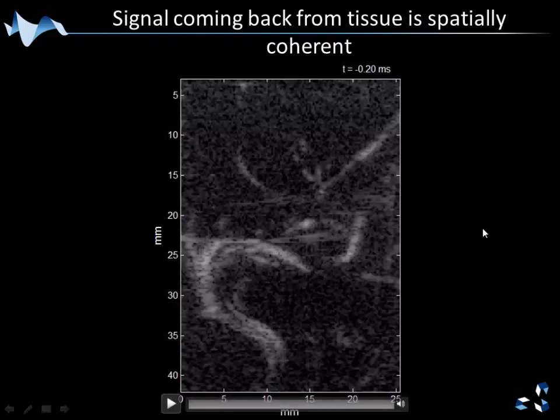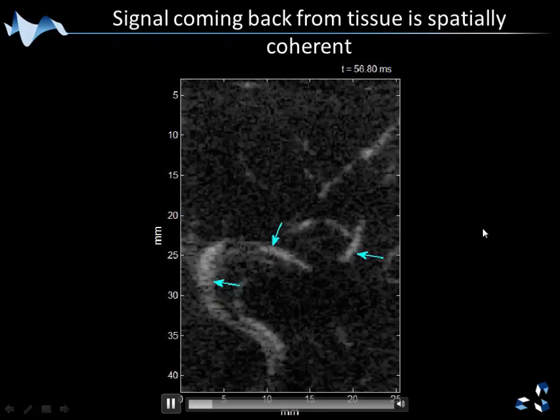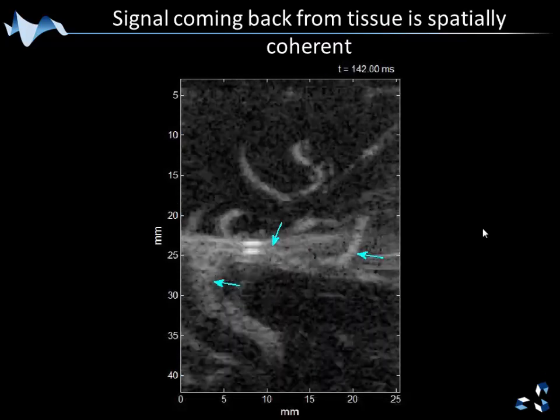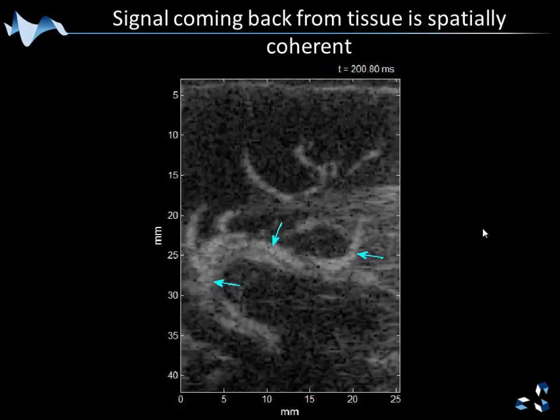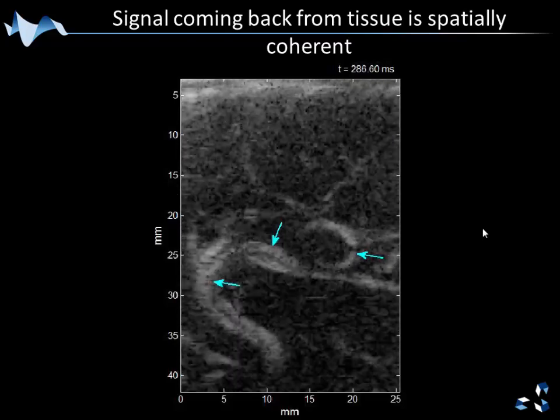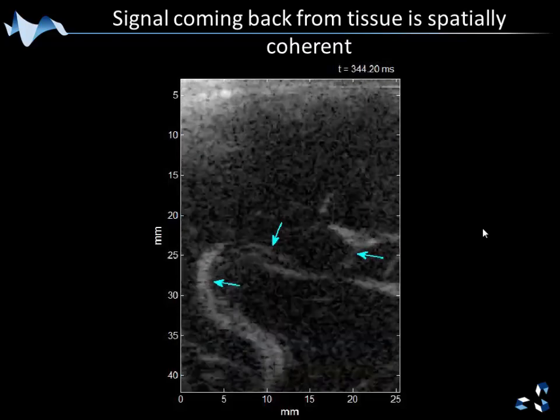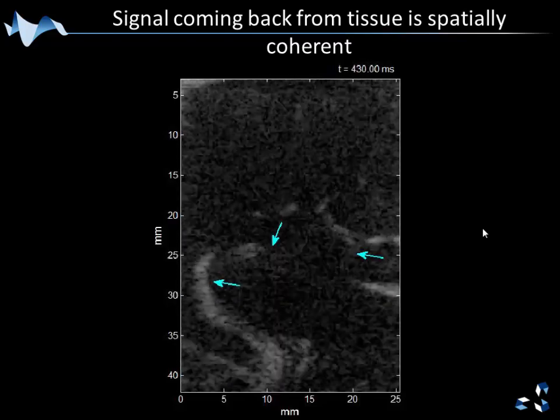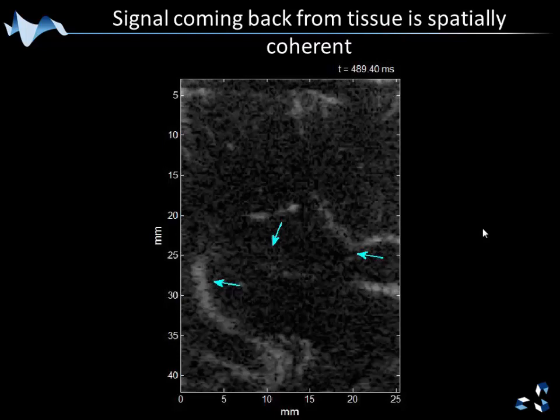However, if we apply a high-pass filter to the ultra-fast data movie I showed, you can see we keep only what's moving in the image. But what's really interesting are the flashing artifacts you see — when the tissue moves, it generates signals with a large spatial extension. This is logical because if the tissue moves, the tissue next to it will follow. As the tissue is cohesive, you will have spatially coherent signals for the tissue, whereas blood flow does not.